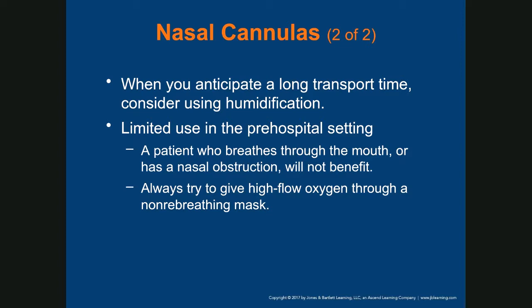So we use dry oxygen in the field. As soon as the patient gets into your ambulance and you need to give them extended O2 therapy, then you can use the humidifier at that point. And you have disposable humidifiers in the States. You have some that are reusable, right?